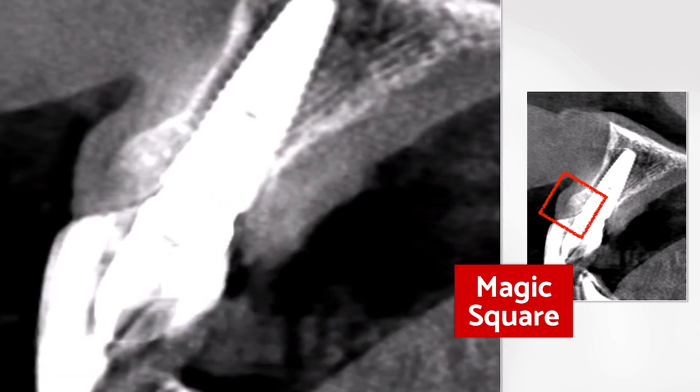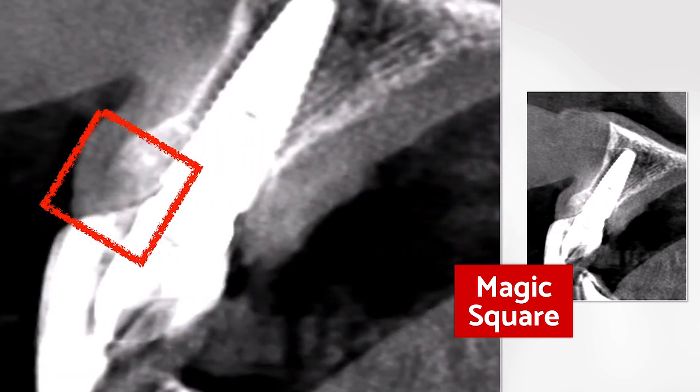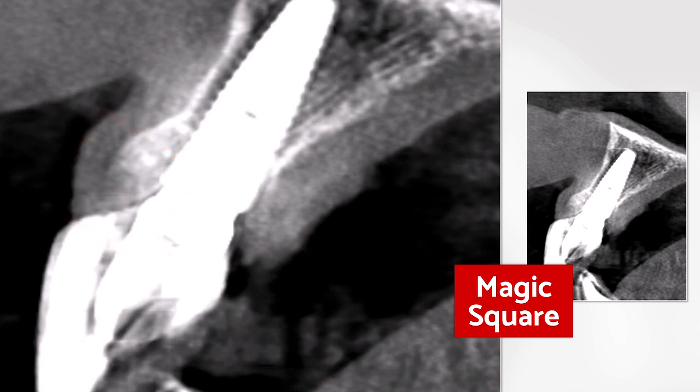And let's take a look at this square that we call the magic square. Just a quick review. The most important side of the square is the 3D position. We have to respect the correct three-dimensional position of the implant in order to succeed.